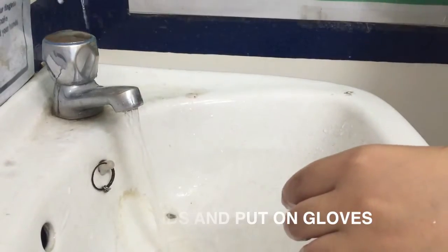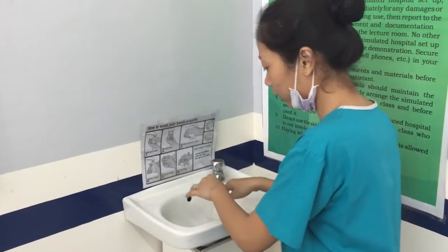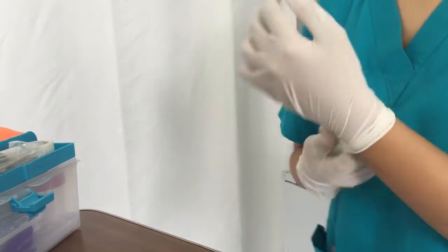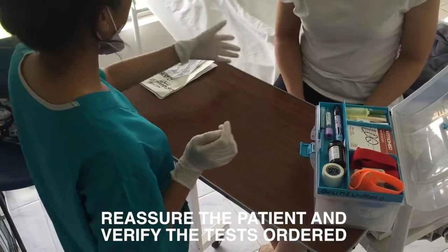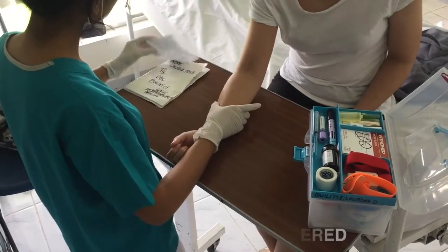Wash your hands in a rotating motion using warm water and germicidal soap. Reassure the patient — as the medical technologist, you must act confident, educated, and experienced.